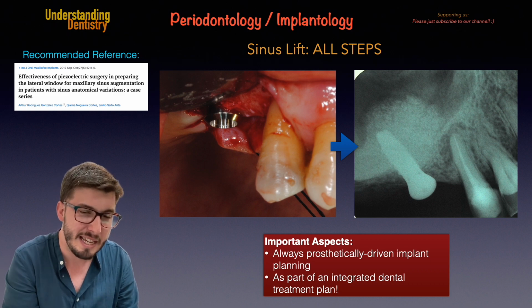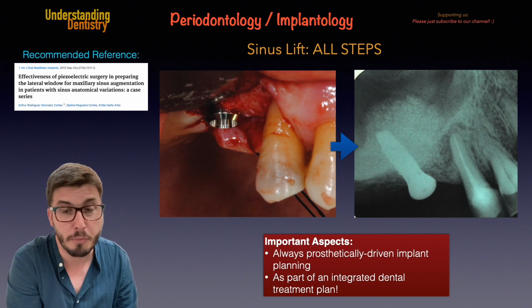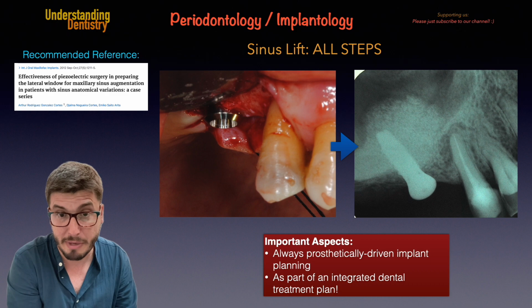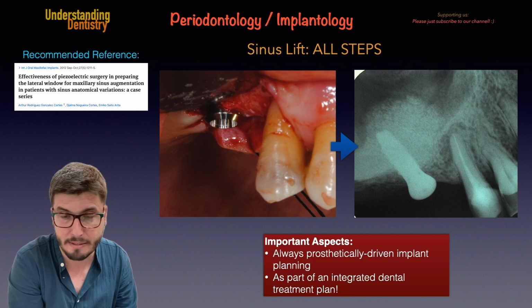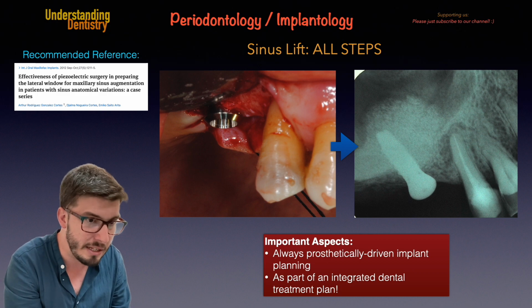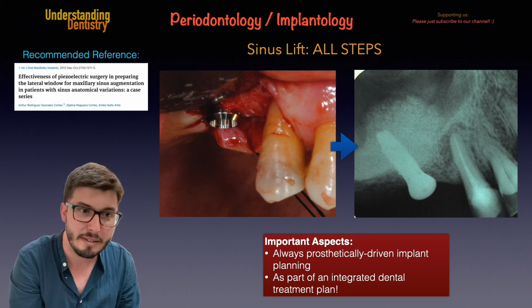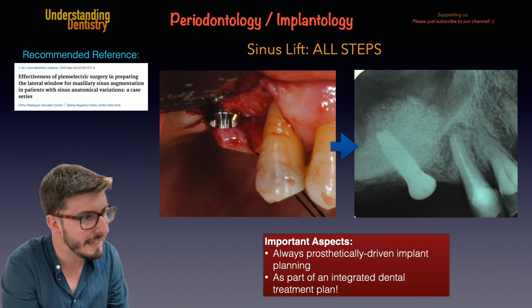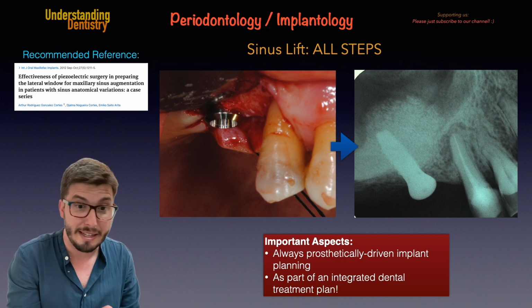Because this patient is elderly, and the bone may vary from patient to patient, the density of the bone. That's the density of the trabecular bone. So we are going to still follow up, of course, but it seems that this lesion could be healing indeed. It's not so radiolucent like lesions are in general. And even if you compare with the radiolucency of the sinus itself, now there seems to be some bone in this area, right? So we could consider that it's healing, but we are going to still follow up this situation, okay? Take a look at the screen again.